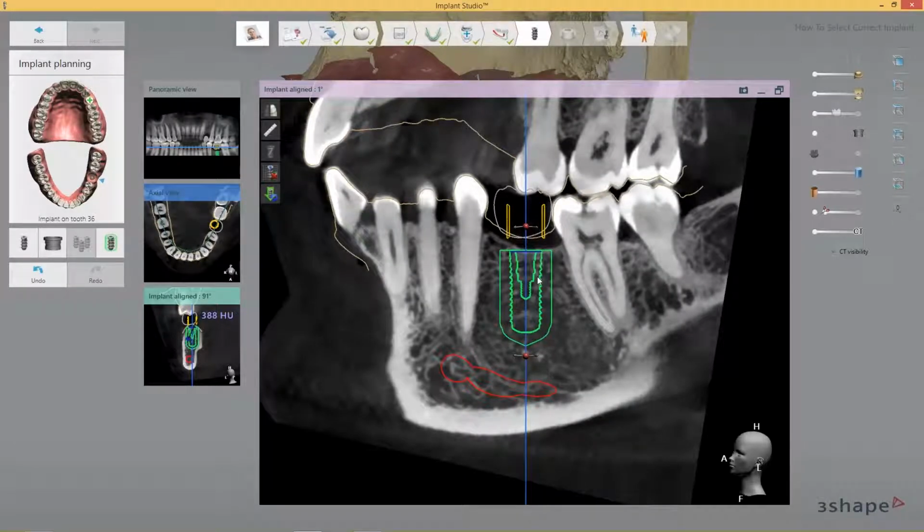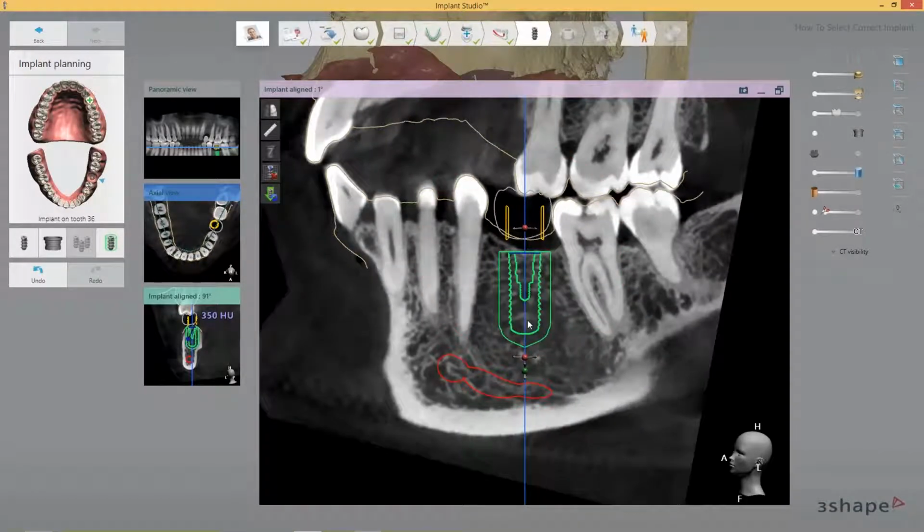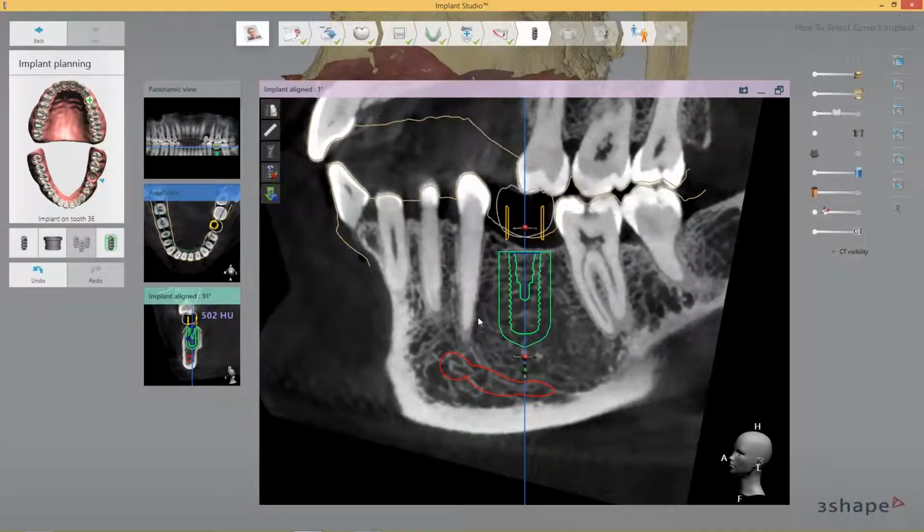And I know that you've made your voice heard internally here also to our development teams, and so small pre-announcement is that some of these clinical diagnostic tools that we really have in the software already, we are improving them, and we are planning to launch them in the first release of 17. So there we have extended, you can say, the clinical value of the software even further. That sounds very nice. I'm very happy to hear that.